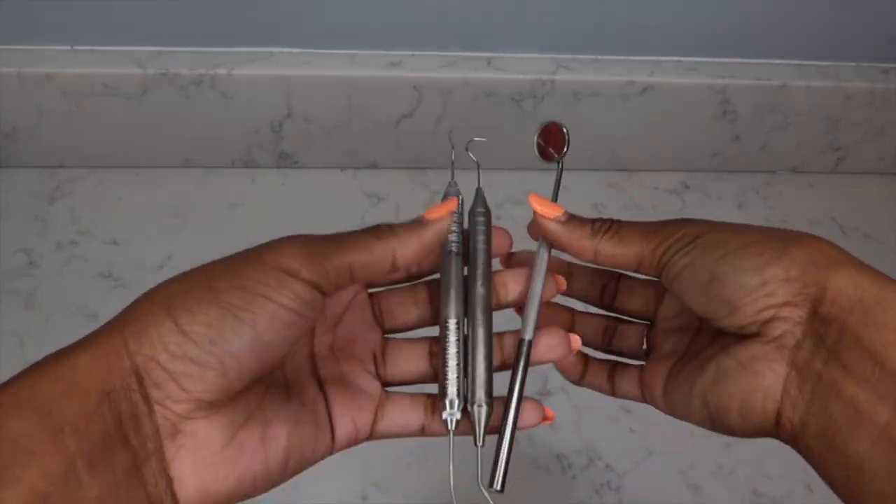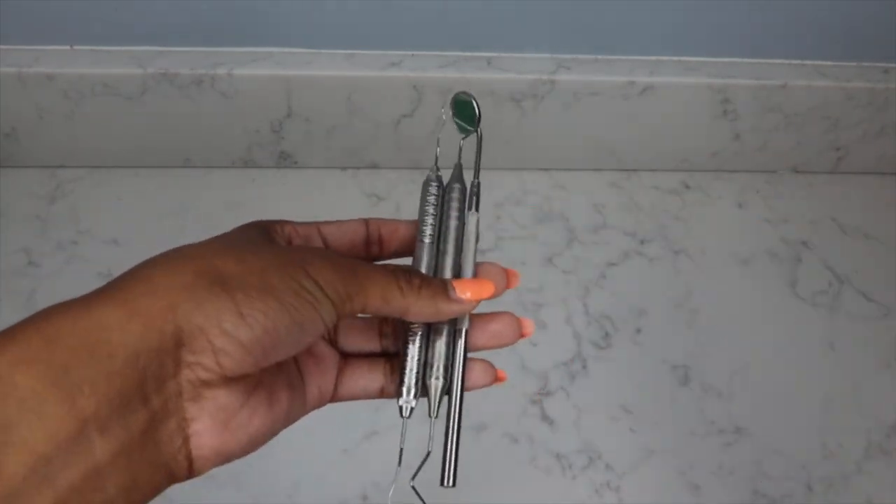Moving on to my third essential as a dental hygienist, which is probably a given — instruments. My favorite brand, hands down, is Hu-Friedy. I love Hu-Friedy from their shank design to the long working ends. Number one is an ultrasonic tip — a universal ultrasonic tip that I can use with my Cavitron on those larger, harder deposits that I don't want to spend a lot of time hand scaling. I just need to bust those up first, then go back and hand scale.